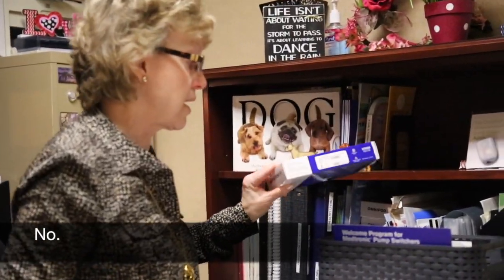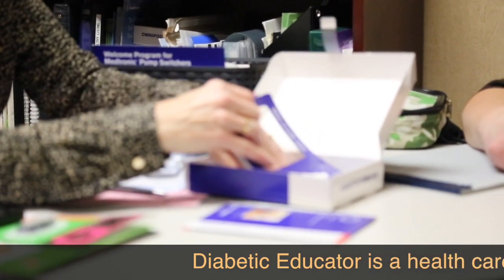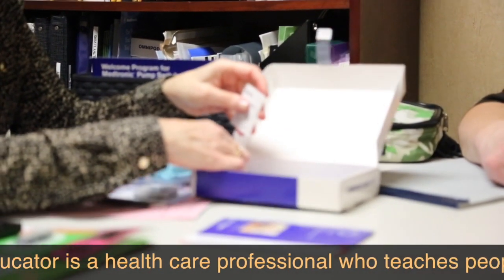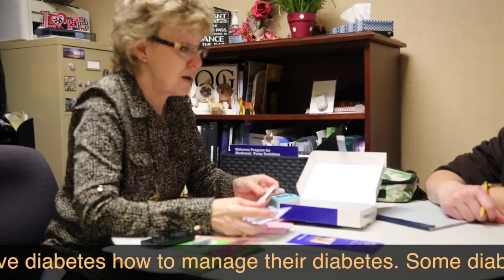Have you actually had the opportunity to wear it? Okay. So, this is a demo kit for you to take home and actually wear, so that you know a little about how it feels. When I first started doing insulin pump trainings, I had two or three, but they all had the tubes on. Omnipod was really new. And I had, how old are you? 11. A guy who was just a little older than you did his research and came to me and said, I will never wear a pump with tubes. I will do this. And I said, well, tell me about Omnipod.